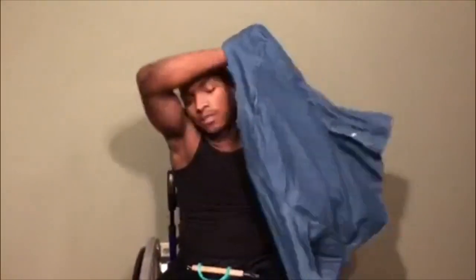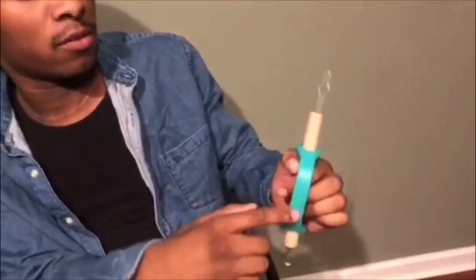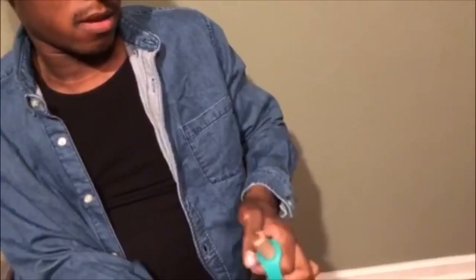I'm going to show you how to button up your shirt using a button hook. For those who are new, I am a quadriplegic C6-C7, and this is a button hook. Because I can't hold it, I had this little brace thing that I put it in.